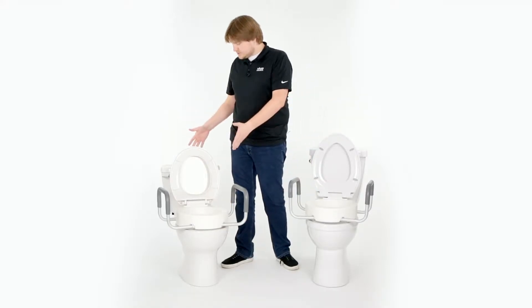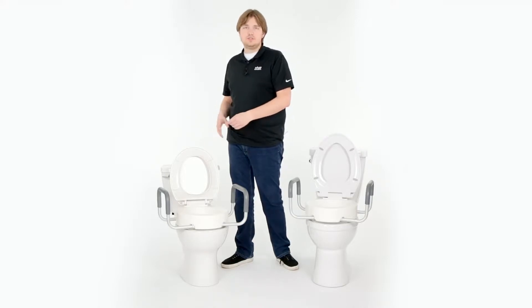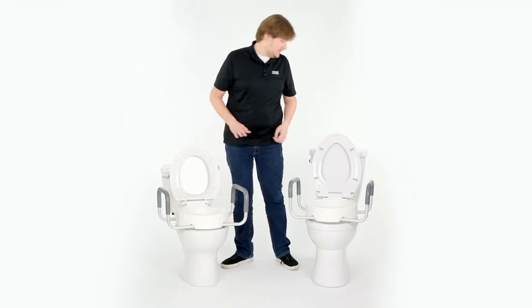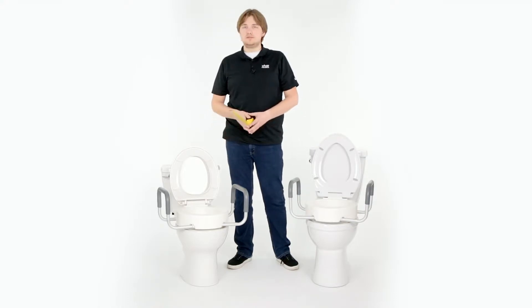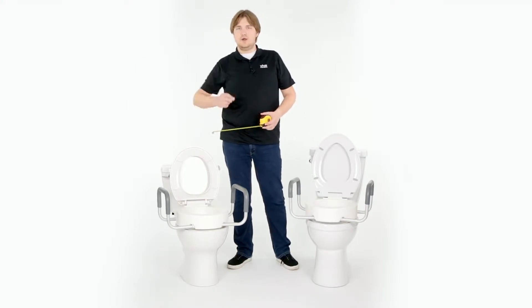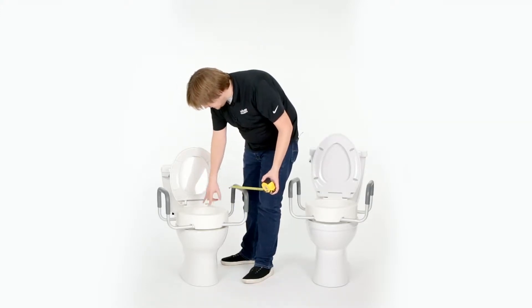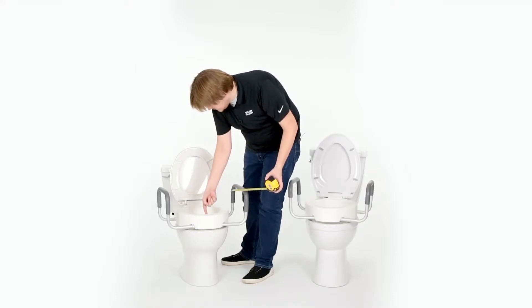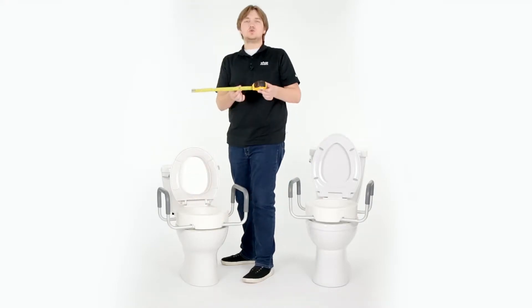The first thing you'll want to do is measure your toilet, and specifically measure the bowl, to determine which size of riser is going to fit your toilet the best. We've just got a tape measure here. What you'll want to do is measure from the back to the front, inside the bowl of the toilet. On the standard toilet, that's going to come to about 12 inches.